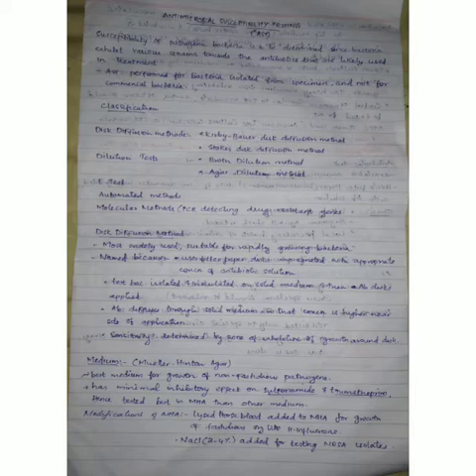This is for rapidly growing bacteria, and it is named so because we use a filter paper disc impregnated with an appropriate concentration of the antibiotic solution. This is why we name it the disk diffusion method. Now what we do in this method: the test bacterium is isolated and we inoculate it on a solid medium, and then the antibiotic discs are applied.